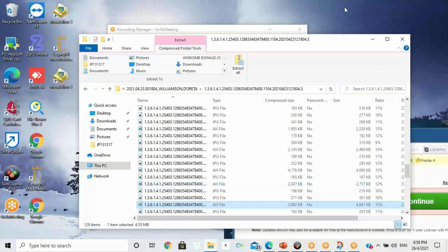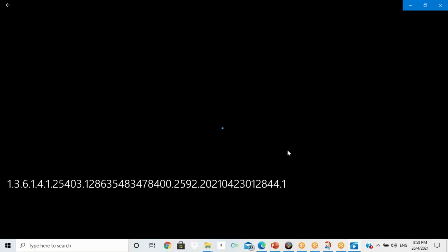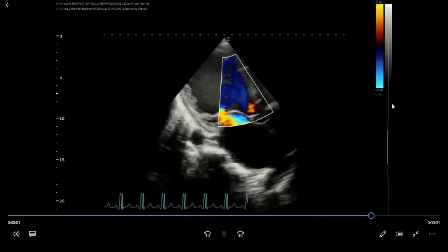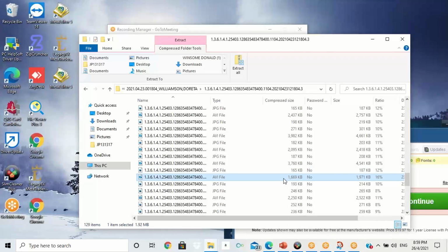Okay, so I think we went through most of the Dopplers, so you should have a fairly decent idea. Next week we'll start hemodynamics, and as I mentioned before, that requires a good understanding of Doppler, because hemodynamics is just pure Doppler.